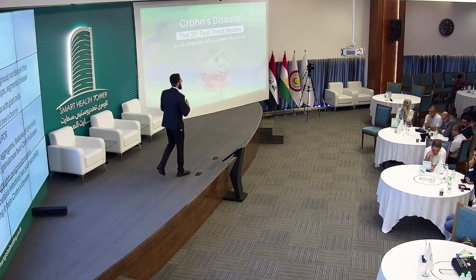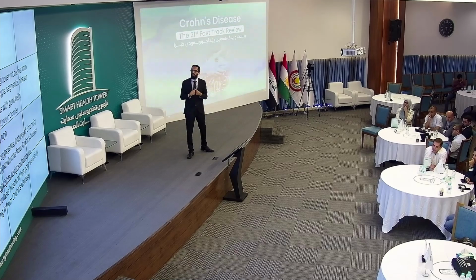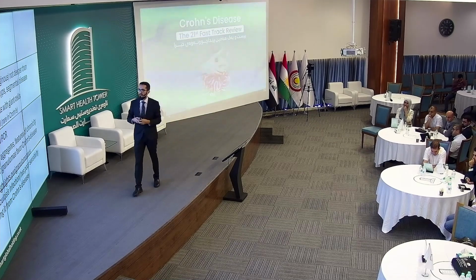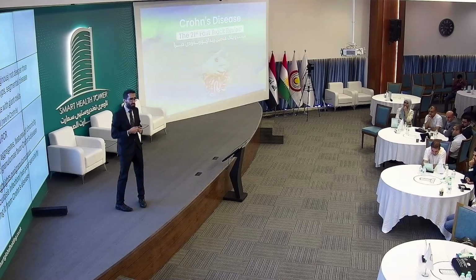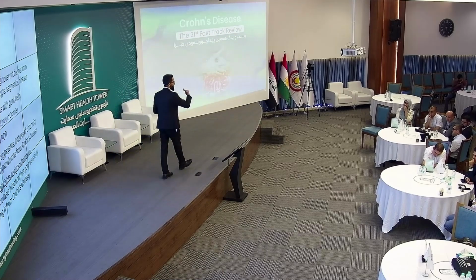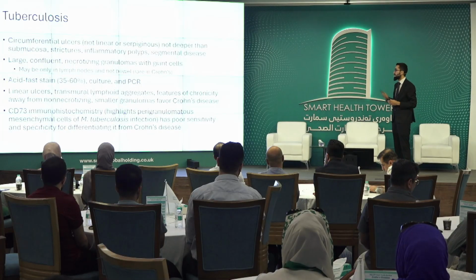We can do, from our part, histochemical stains. We can do acid-fast stain for the mycobacteria, but this is not very sensitive. Only about 40–50% of them will detect it. So it's better if you suspect it endoscopically to take a fresh biopsy along with the biopsy that you send to us. You take a biopsy and send it for culture because that's more sensitive, or PCR.